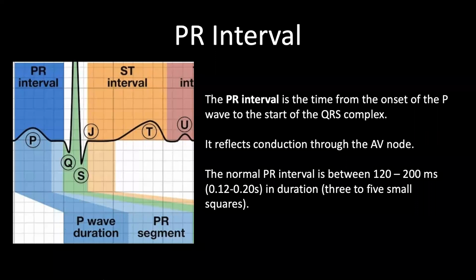The PR interval becomes useful when you're thinking about heart blocks, for example, first degree, second degree, and third degree heart blocks, again, of which we'll touch upon next week.